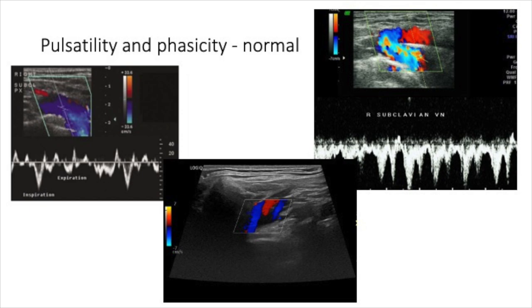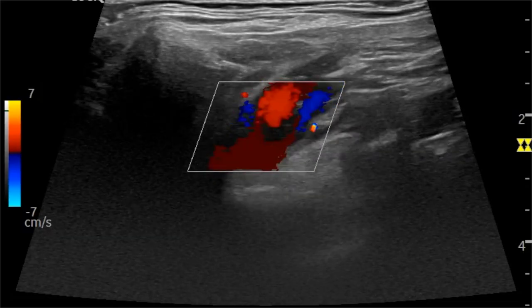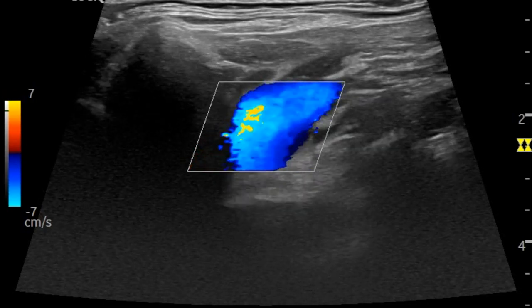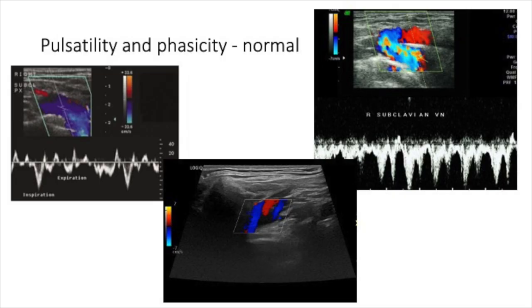When doing a Doppler you need to document certain waveforms. When you sample the subclavian vein and switch on color, you first typically see a pulsatile signal — red changing to blue — which tells you that the vein is pulsatile. When you actually sample the vein you see a typical pulsatile pattern with a deeper wave seen during inspiration, as the intrathoracic pressure dips with inspiration, giving better venous flow; during expiration the same peak is weakened. This is typical respiratory phasicity. The pulsatility tells you that central veins are patent, as transmitted cardiac pulsations are well depicted in the veins of the neck, indirectly indicating that the brachiocephalic vein and SVC are patent.